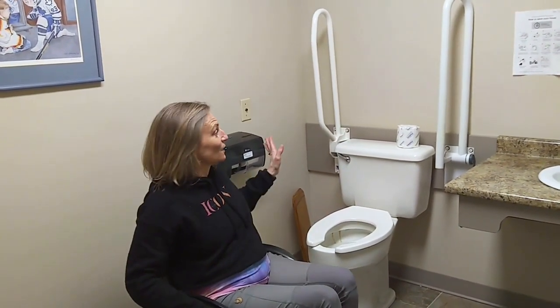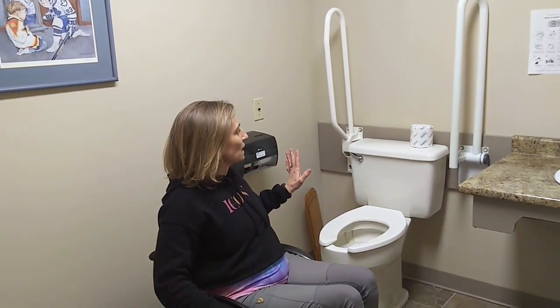Julie Spalchuk here to talk to you again about grab bars. I've got two different grab bars in this bathroom, and I want to show you that not all grab bars are created equal. There are some that work in some situations and some that don't.